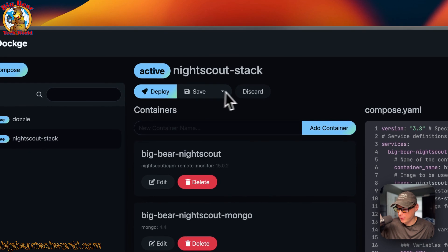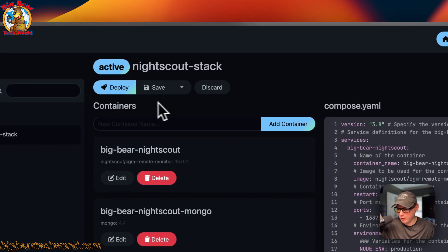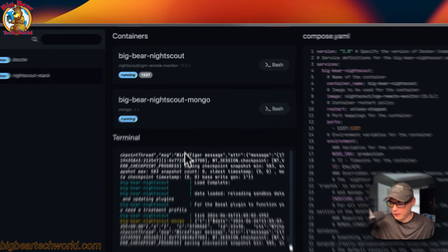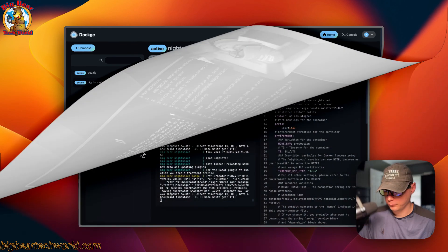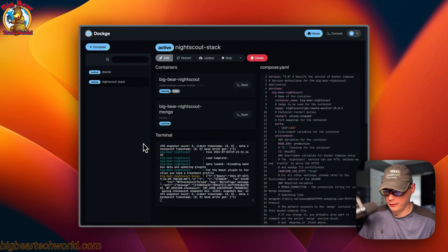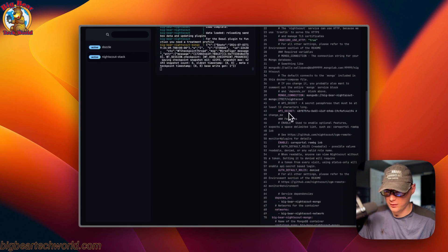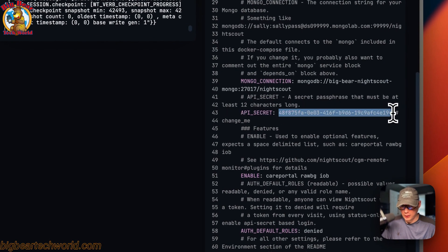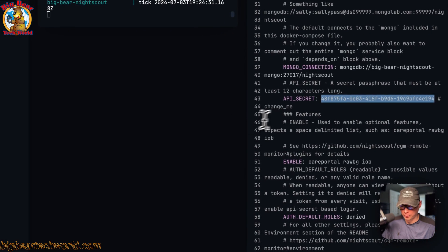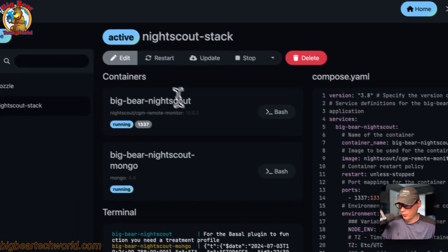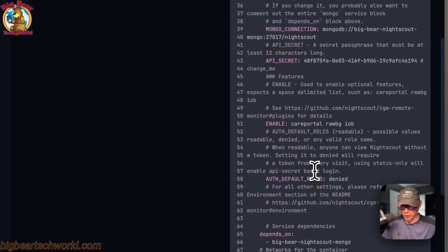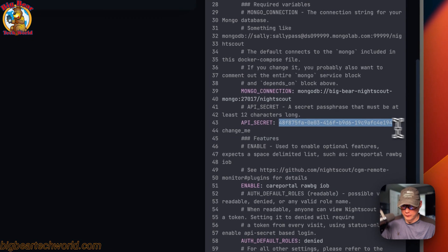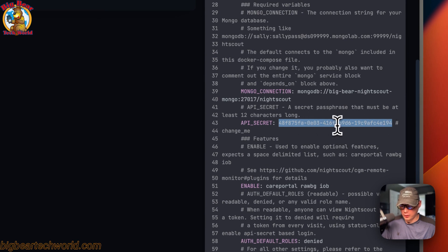Up here under Actions you can deploy changes, save changes, stop and inactive, or discard changes — I'm going to discard the changes. That's an overview of the Dockage UI for this stack. Now I need to find the API secret token. You can copy it from here, and as mentioned you should replace it with something different — a custom UUID v4. Go to Edit, find the API secret field, and replace it with your own UUID v4. You can then copy it.